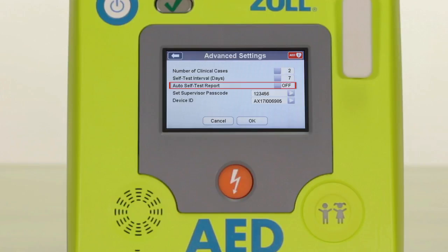If you are not using the automatic Wi-Fi feature to transmit your device status to your program management software, you should disable this by turning the auto self-test feature to off. If you are transmitting to program management over Wi-Fi, you should enable this feature by selecting on.